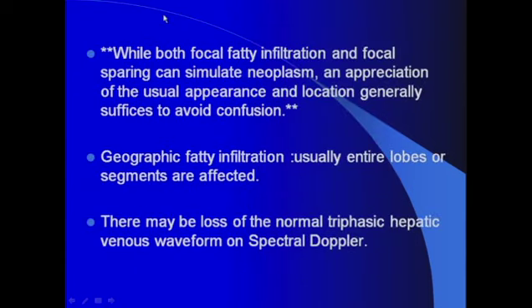While both focal fatty infiltration and focal sparing can simulate a neoplasm, an appreciation of the usual appearance and location suffices to avoid confusion. This confusion can be averted if you supplement your study with color or power Doppler.